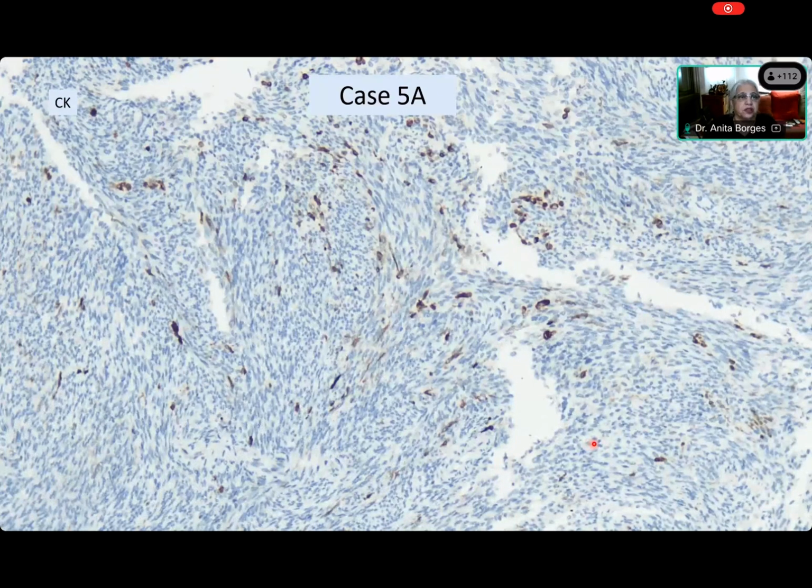Now, what is this? Cytokeratin and cytokeratin. Now you can see how the spindle cells are very focal, and this happens with all monophasic synovial sarcomas. If you expect that every cell or every second cell is going to be positive, you will not find that it is so. Right? Look at the individual foci here and there that are positive.